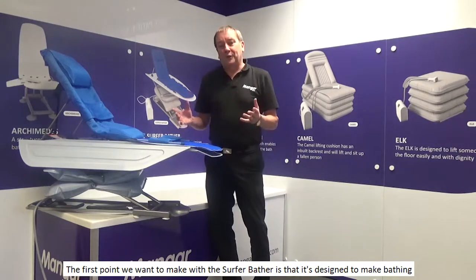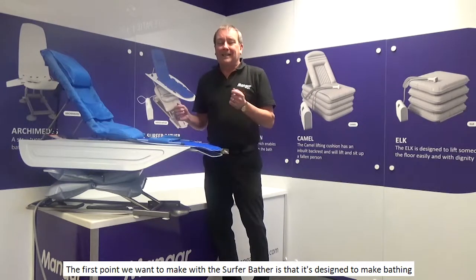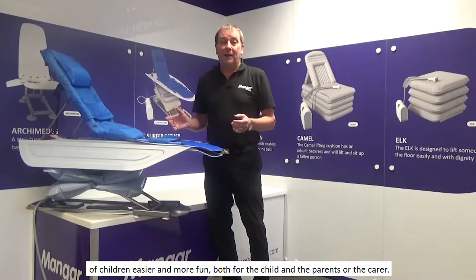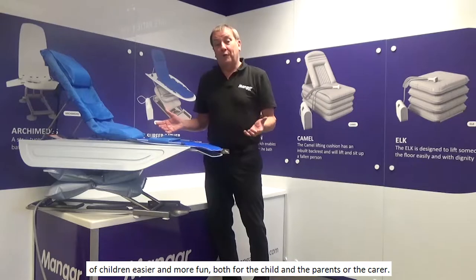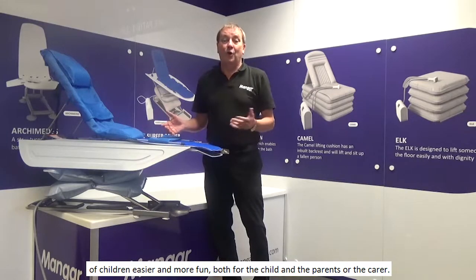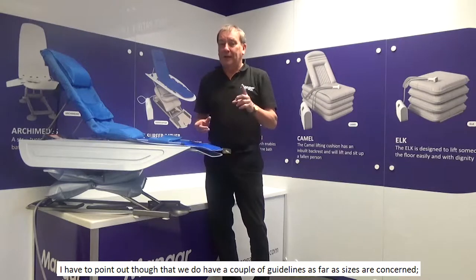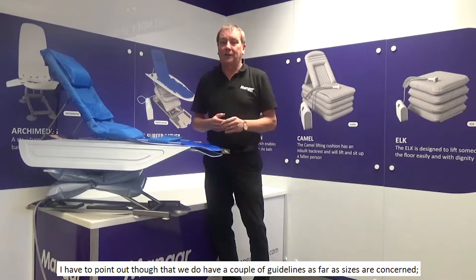The first point we want to make with the Surfer Bather is that it's designed to make bathing of children easier and more fun, both for the child and the parents or the carer. We do have a couple of guidelines as far as sizes are concerned.